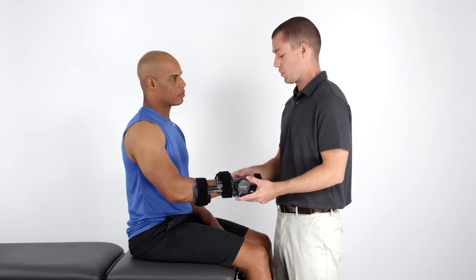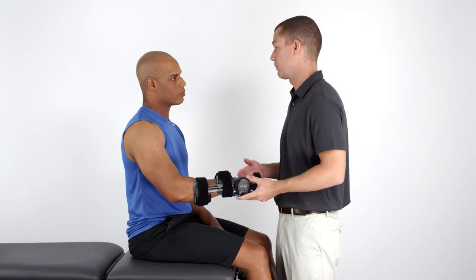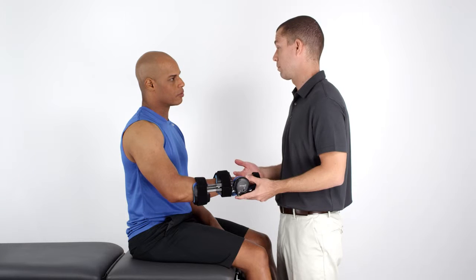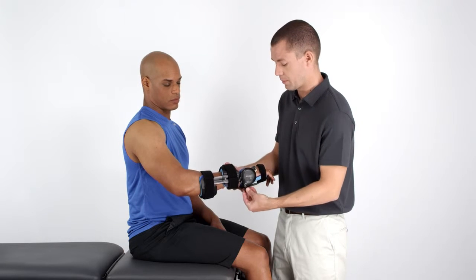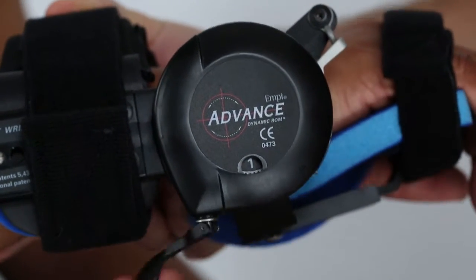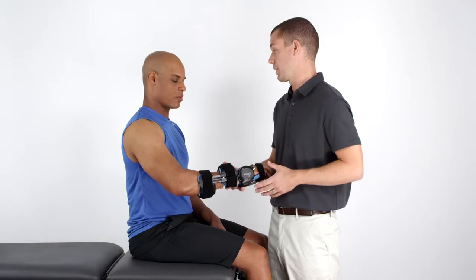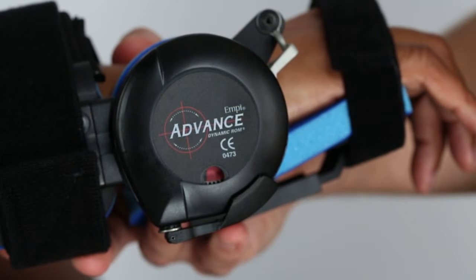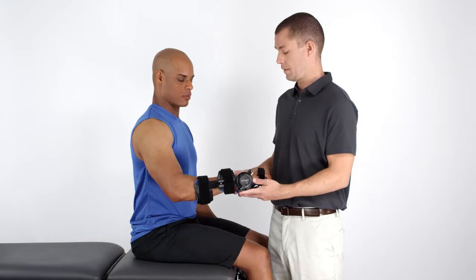Monitor the patient to determine their tolerance to the device. If the patient cannot tolerate the initial tension setting and wear time, a physician or therapist needs to reevaluate the patient. If the patient can comfortably wear the device during this initial period, their treatment time can be increased. To increase or decrease the torque, flip the tension control lever away from the tension spring cover and turn the lever in the desired direction. It's very important not to over-tighten or over-loosen the tension spring, as either action can damage the mechanism. A solid red bar in the tension indicator window before 0 or after 10 is a warning signal that you've turned the lever too far in either direction.